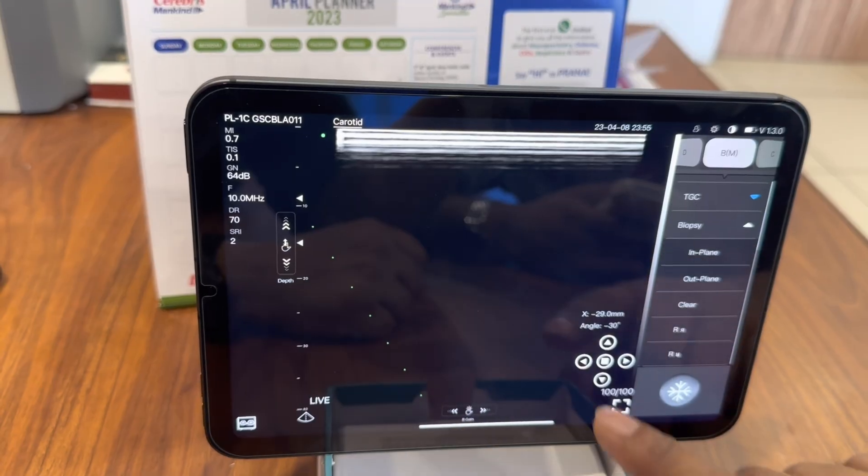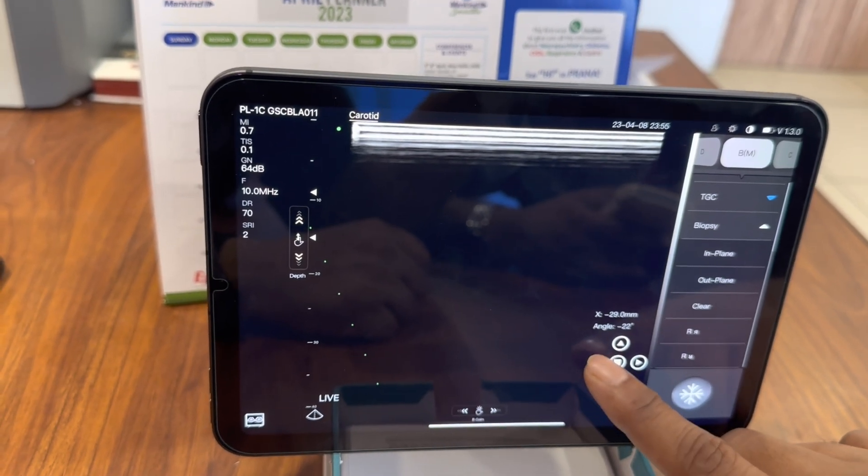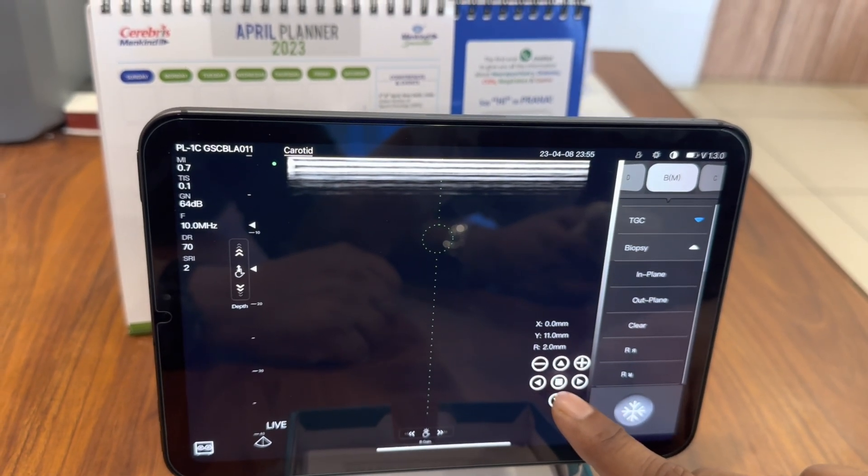It has a biopsy assistant mode. You can do an in-plane or out-of-plane biopsy so that you can easily pass the needle where you want to go.